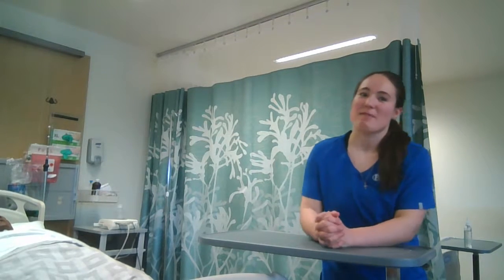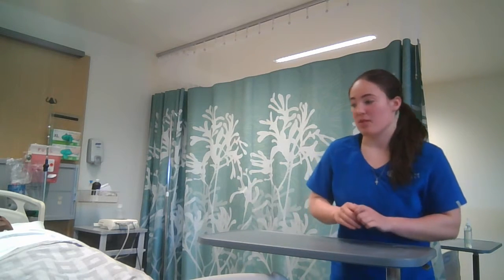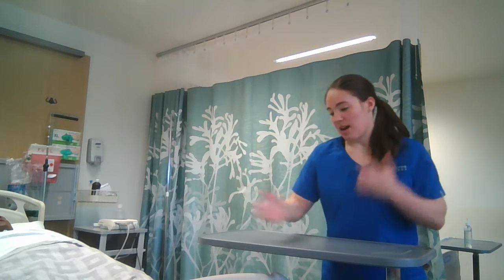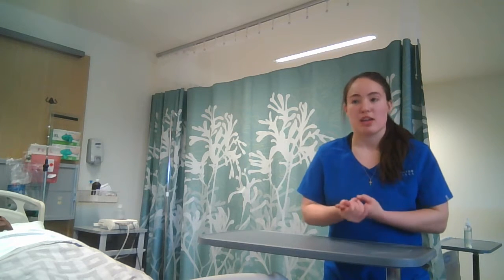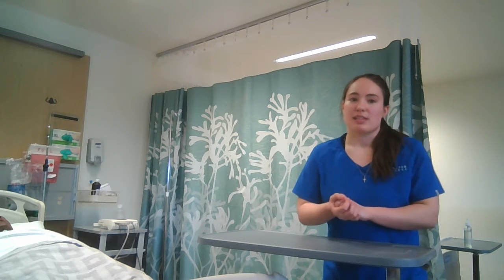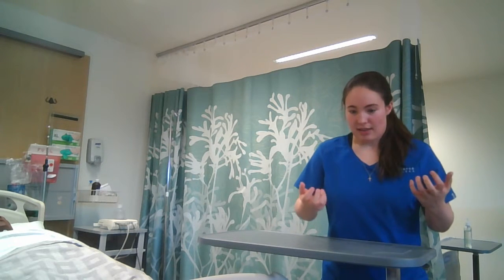All right, so I'm going to be giving my inhaled drug administration. Currently I'm in the medication room, so I would perform hand hygiene, and I have my MAR sheet in front of me. As I'm getting my medication out, I'm making sure that it's the right patient, the right medication, the right dose, the right route, and also the right time. So I'm just verifying all of that. And then I'm also discussing the nursing considerations indicated on the Skills Lab medication administration guidelines.